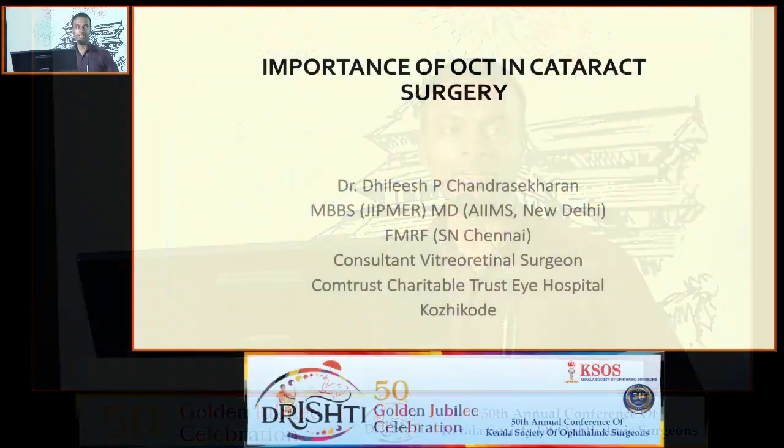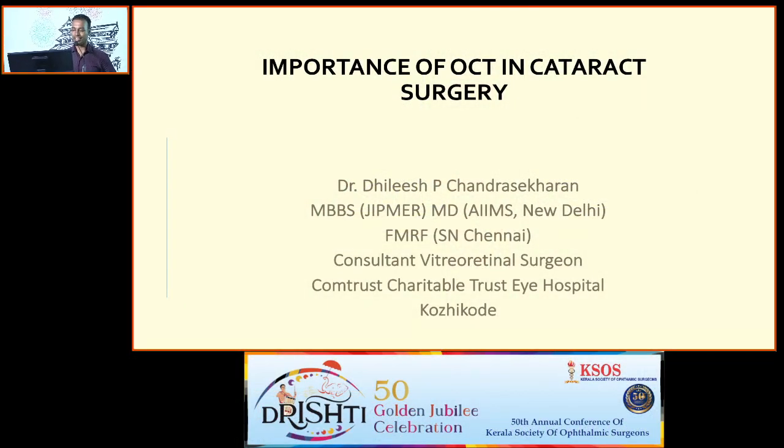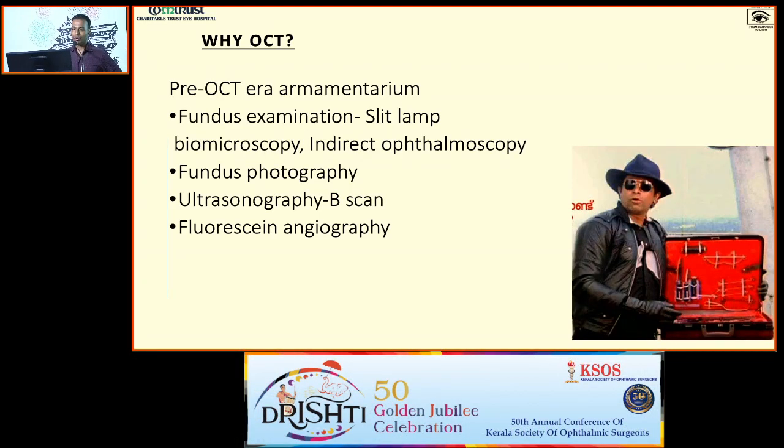Good morning, everyone. I'm Dr. Dhileesh P. Chandrasekharan. I'll be talking about the importance of OCT in cataract surgery. So, in the pre-OCT era, the armamentarium of the cataract surgeon to diagnose retinal diseases and macular diseases consisted of fundus examination through slit lamp biomicroscopy and indirect ophthalmoscopy, and fundus photography, and investigations like ultrasonography and fluorescein angiography.